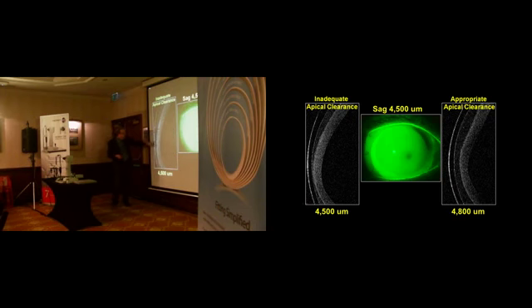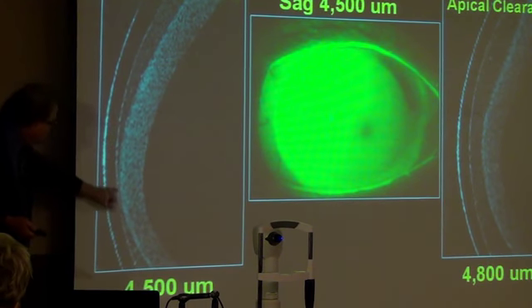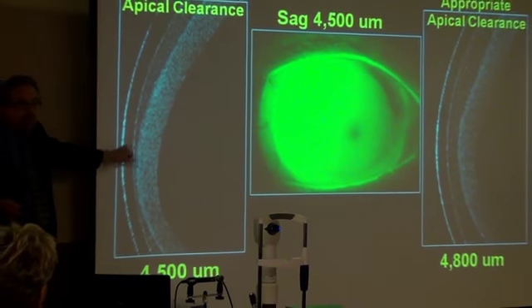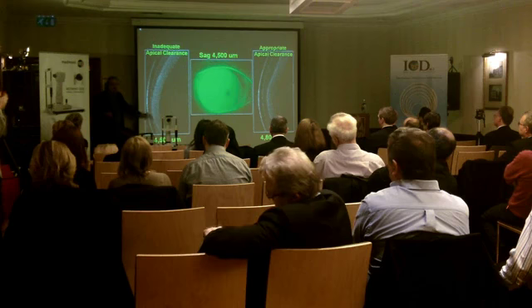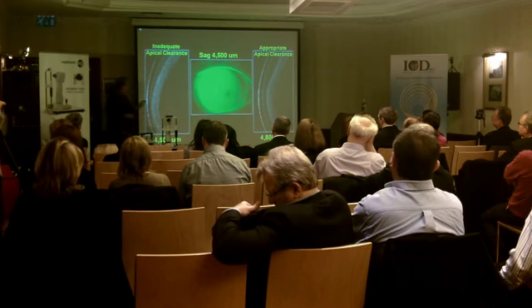So here is what this lens looks like, that initial diagnostic lens. Here we can see the fluorescein thinning in this area. It may not be touch, it might be just fluorescein thinning, but it will be touch after that lens settles in.